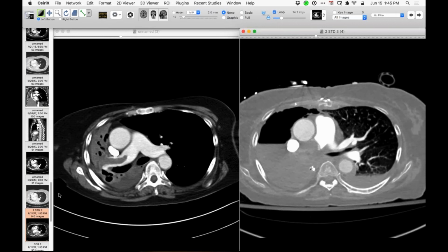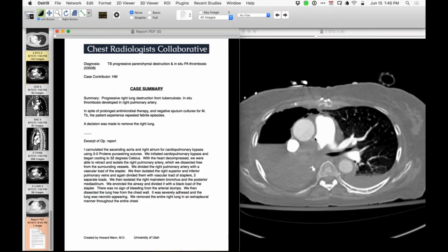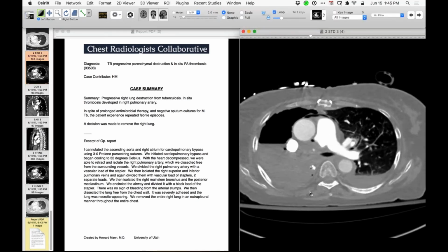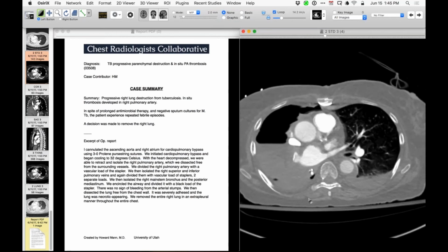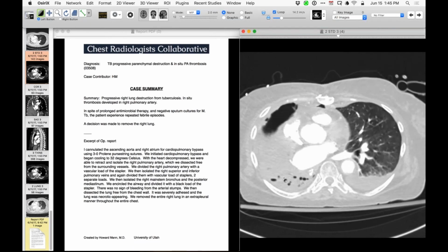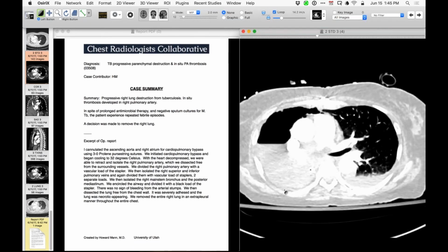And you can see they did this under cardiopulmonary bypass. They went in there and did the pneumonectomy. This is a very proximal stapling off of the right pulmonary artery, and they took out the right lung. I'm not quite sure of the clinical context in which the repeat CT was done, but there's air and fluid in the post-pneumonectomy space. But I think it's the first case of a stump, kind of analogous to a stump thrombosis I've seen in the case of this. Has anyone seen something quite like that?